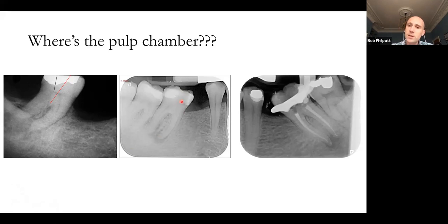And actually this person, when they did it, really knew what they were doing, because they stopped just in time to the point where they said, I should be finding canals here, what's going on? And they would have been resting right onto the pulp chamber roof at that stage. And in a tooth like that, it probably would have been relatively easy to find the distal canal. And then you say, well, okay, this is simplified now. I know where the distal canal is. So therefore I should find it easier now to get into these mesial canals as well. So for me, they have stopped at just the right time, but measurements and lines and different things aren't going to help here because the orientation is slightly off.